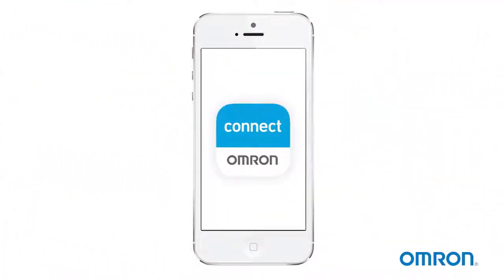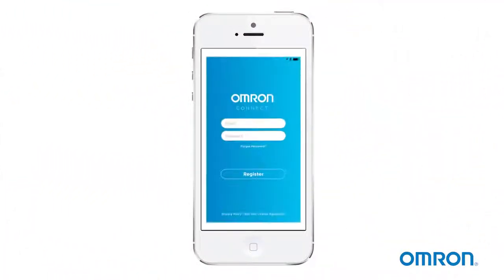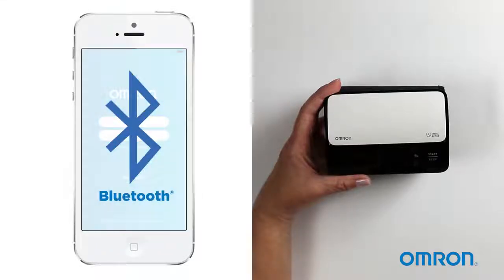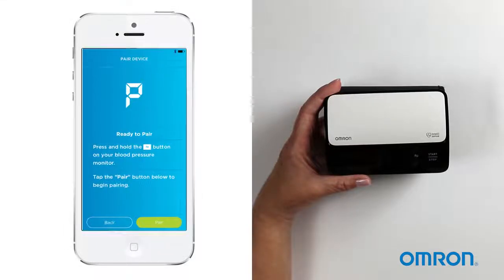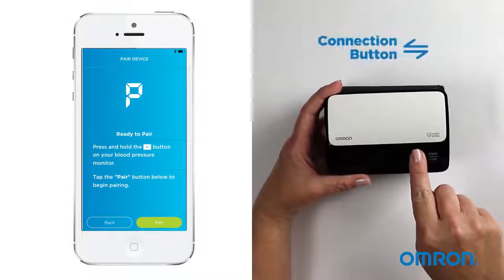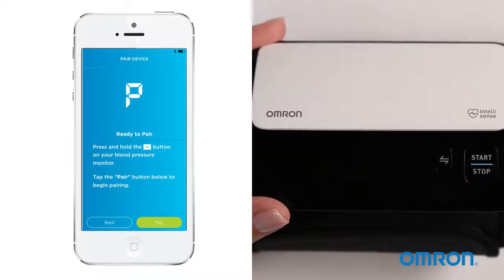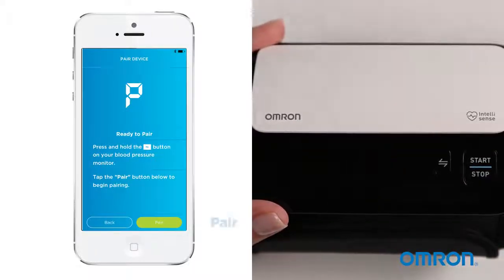Now download the Omron Connect app to your smart device. Next, pair the devices. To do this, turn on your phone's Bluetooth. Open the Omron Connect app and press the connection button on your Evolve for 5 seconds. Then tap the pair button to complete the setup.